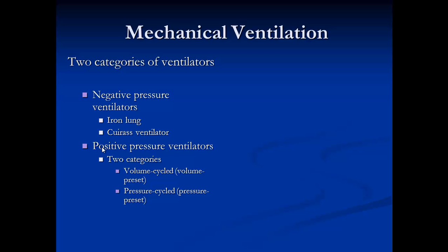On some ventilators, the setting of peak inspiratory flow rate and the choice of inspiratory flow waveform determines the length of inspiration. As lung resistance and compliance change, some ventilators adjust inspiratory flow to maintain not only the preset tidal volume but also the preset inspiratory time. With volume cycle breath, worsening airway resistance or lung chest wall compliance results in an increase in peak inspiratory pressure with continued delivery of the set tidal volume.